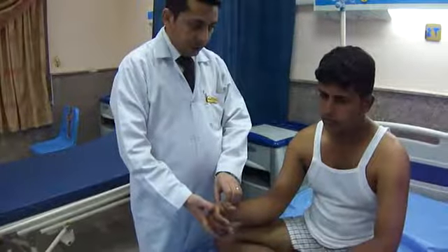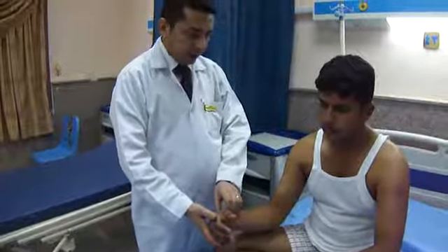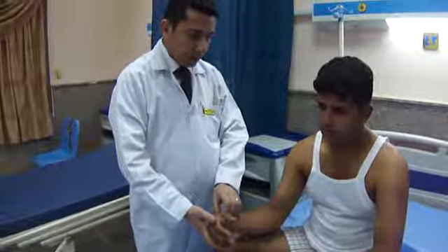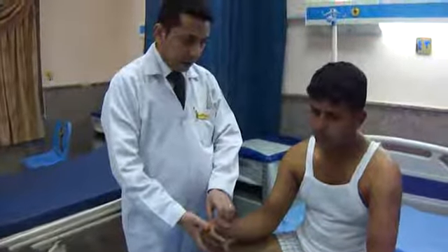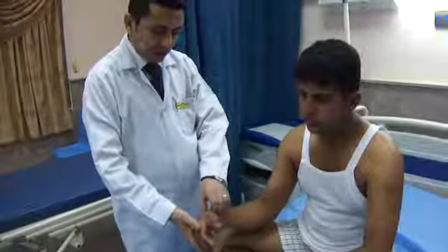recoiled, which indicates the respiratory rate, which is normally from 14 up to 18, and sometimes it is lesser than this. If the patient has an abnormal respiratory rate, you have to check it for a full minute. If the patient has a rate more than this range, that's to say more than 18 and more than 20, this is what we call tachypnea.